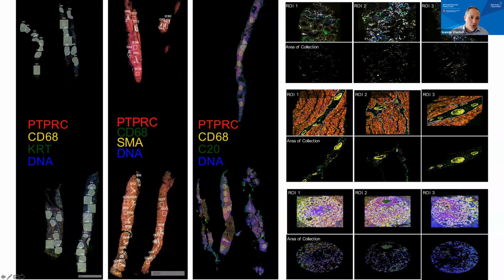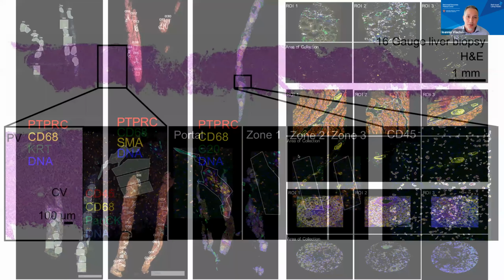And for instance, this is a region of interest selected free form here. Or another powerful approach is to use the markers and select only the positive cells or negative cells, or separate them per region of interest. So in this example, you can select your CD45 separately, and your pancytokeratin, or use the channels to select regions and sequence them separately.